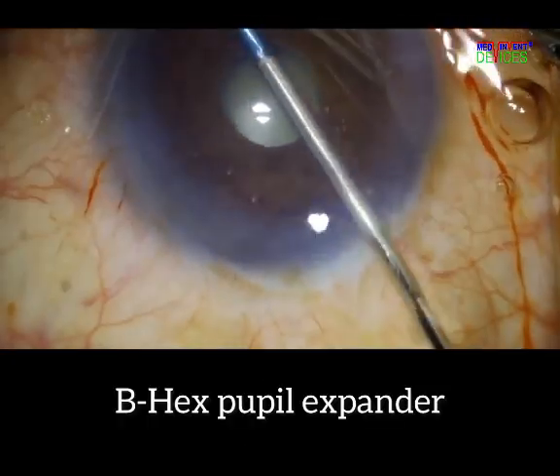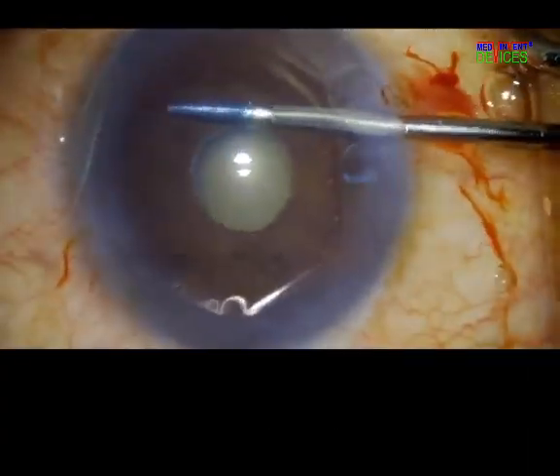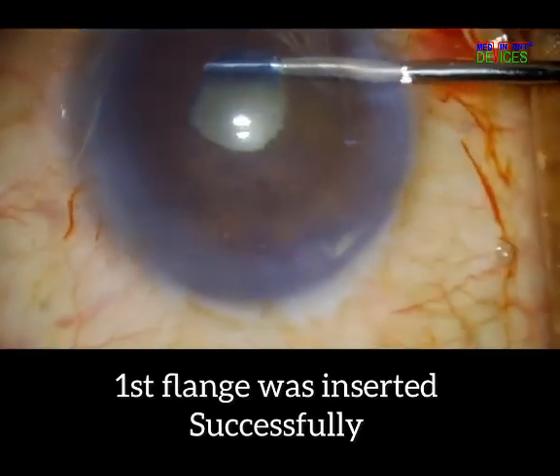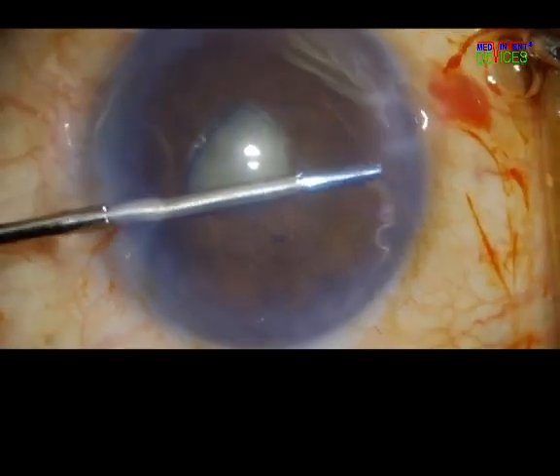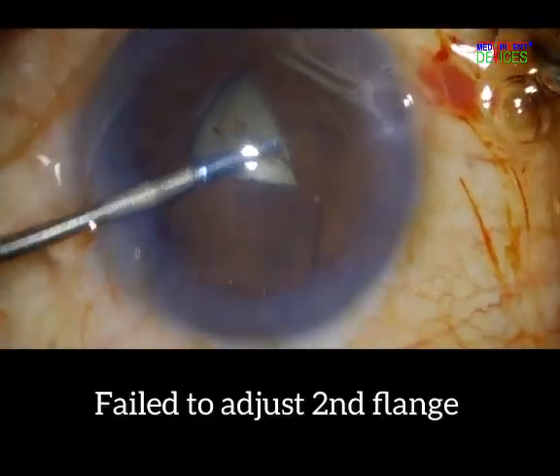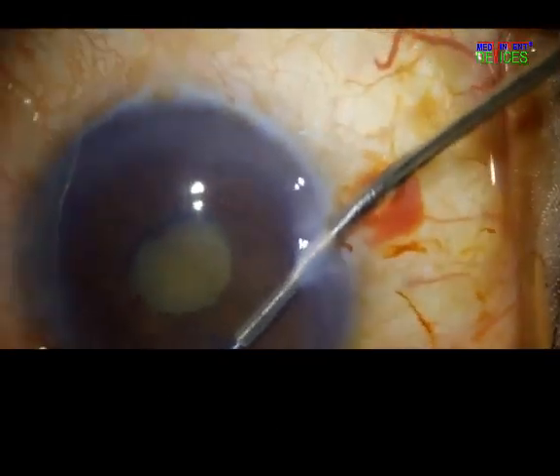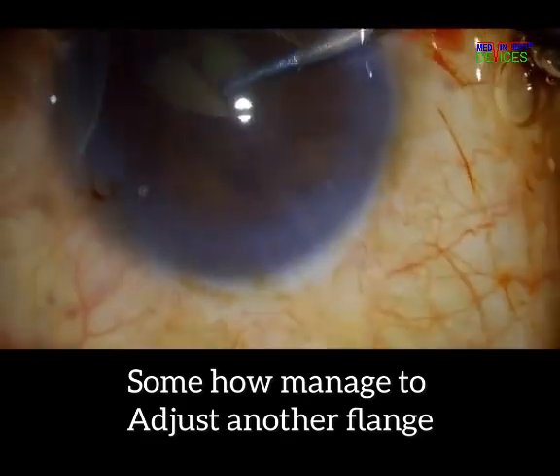The B-Hex is inserted with the B-Hex forceps. The first flange is tucked — so far, so good. This is the first attempt at tucking the second flange; it didn't go as desired. And the second attempt at tucking is successful.